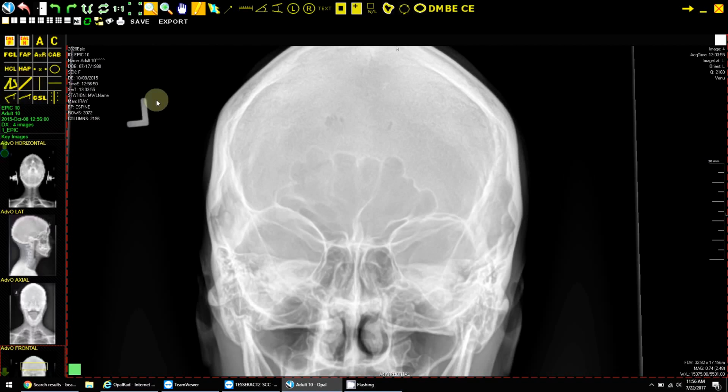I was talking with Chuck, and he wanted me to make a quick video on how your tool works for the CSL, the orthospinology central skull line.